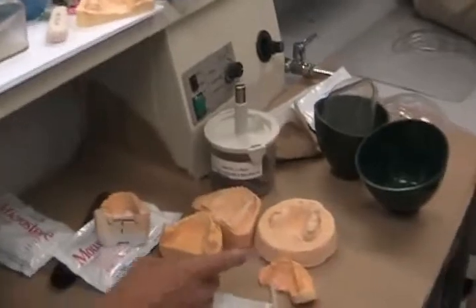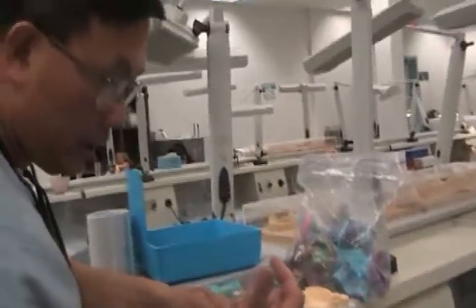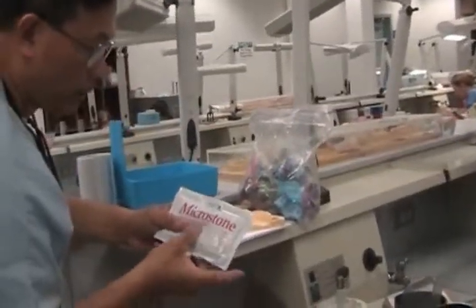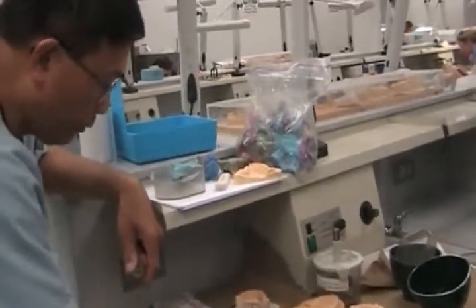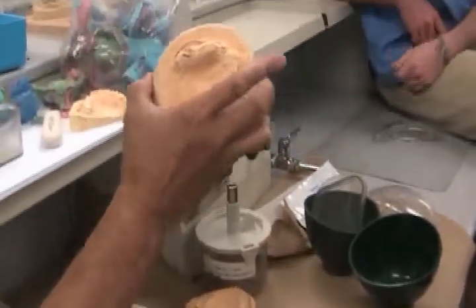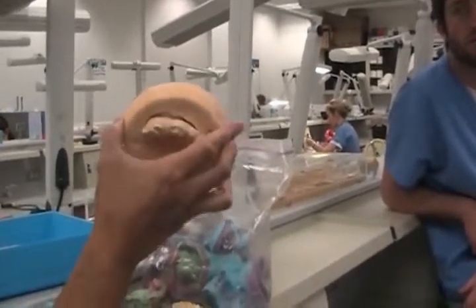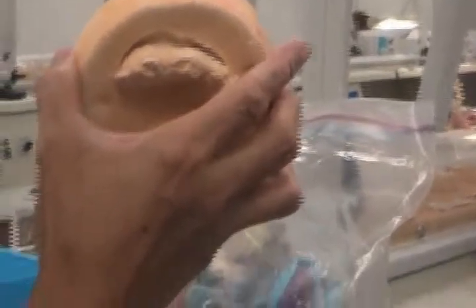But if it's a denture case and it's the final, I use the yellow. I'll show you the different stones you should be familiar with later. So we've covered what to look for. Let's say you have a mandibular impression and this is an alginate impression. This is a technique where somebody put up some alginate — maybe twice as much — put it in a larger mixing barrel.